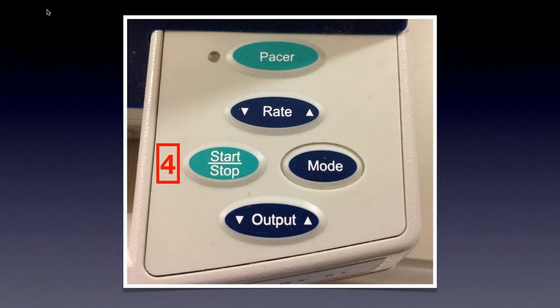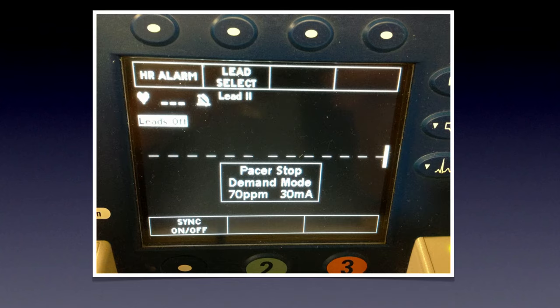The start/stop button turns the pacing function on and off. In demand mode, the pacemaker only fires a pulse when needed. If the patient's heart rate is 80 and the pacer is set at 70, it fires no pulses. If the native rate is 20, it fires 50 pulses per minute to reach 70. However, the transcutaneous pacemaker cannot sense and pace through the pads alone — it needs leads to sense and pads to pace.